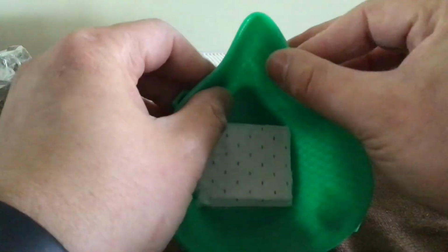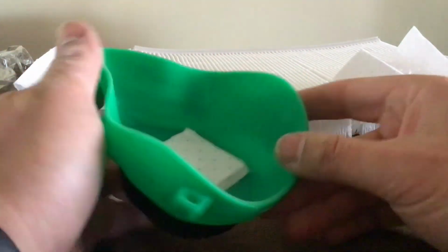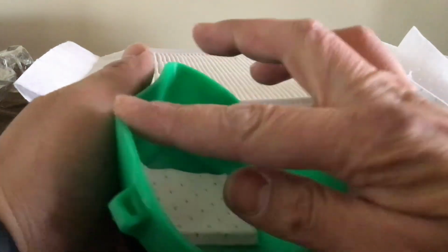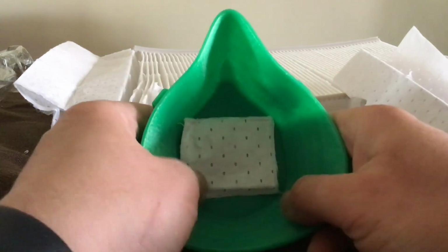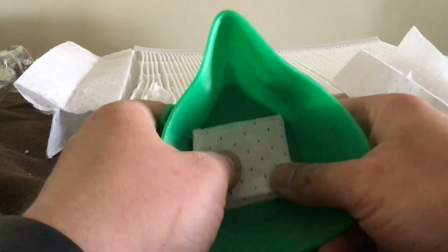Now this one doesn't have a silicone seal on the back yet, so I'll be doing that after the fact on this one. Some of the ones that you'll be getting will have a silicone seal on them already. Doesn't really matter, the process is going to be the same. And I'll go over putting the seal on those in a different video.